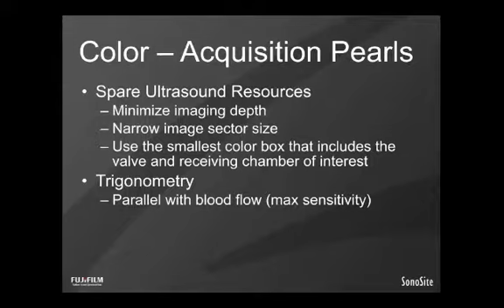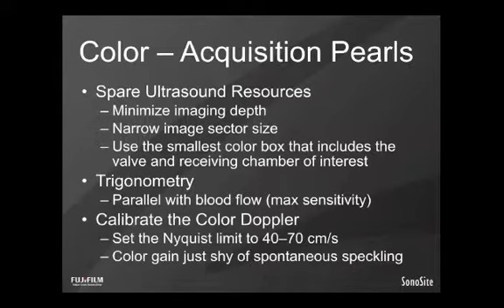Being aware of the trigonometric applications and influence of the Doppler technique, that parallel blood flow is most accurate, though we've talked a lot about how non-parallel flow can still be used. If you really have a lesion of interest, it makes a great deal of sense to do your best to look at that in a parallel fashion.